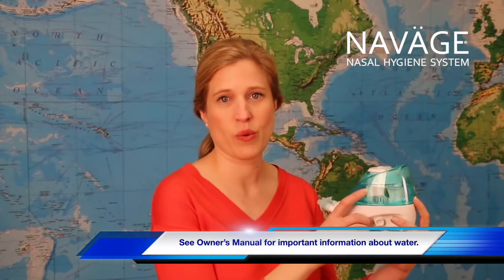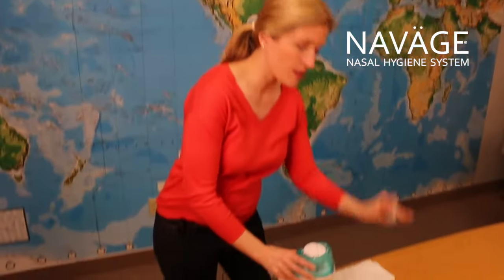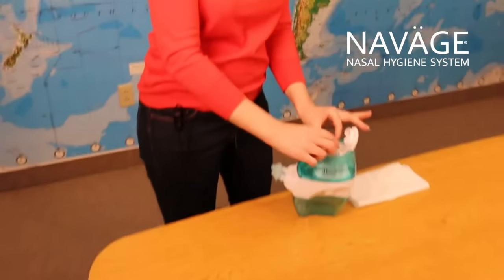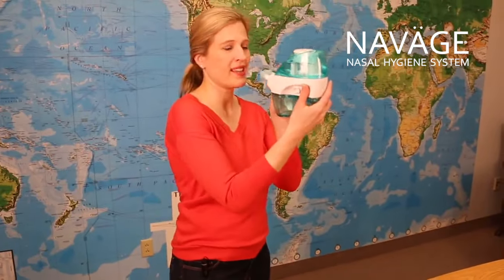I'm going to show you the Navage Nose Cleaner today. I've filled the upper tank with water up to the fill line — I have warm water in here. I'm going to take one of the salt pods and put that into the crushing chamber, close the lid, and now I've just created my saline solution.